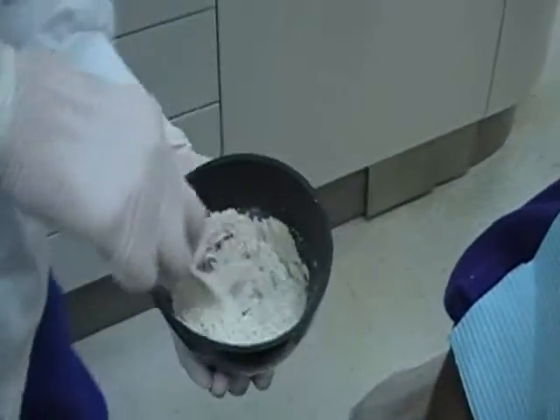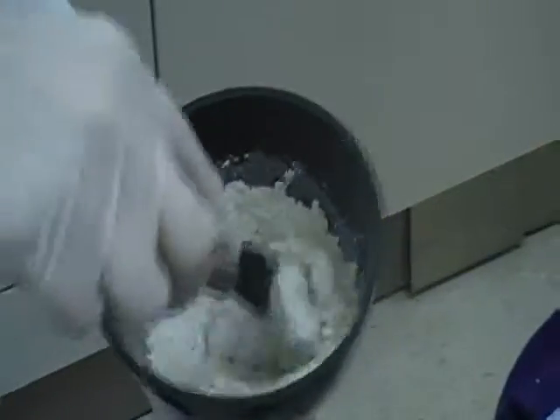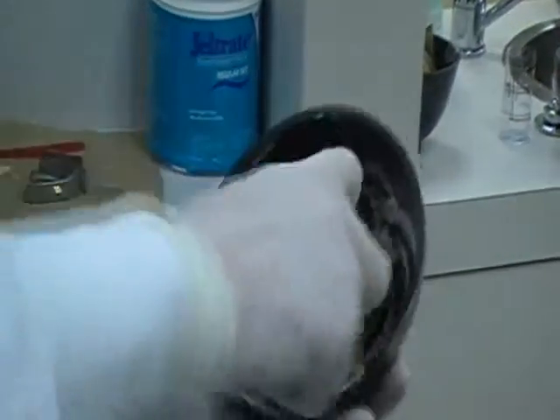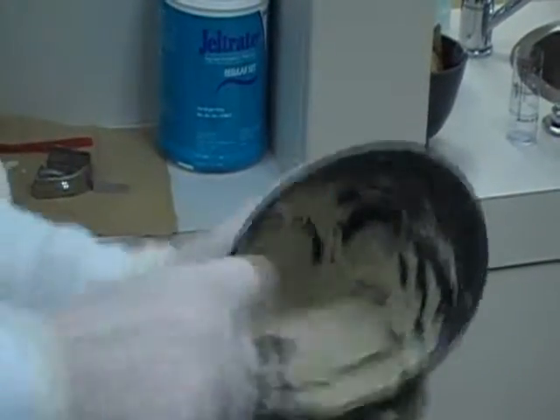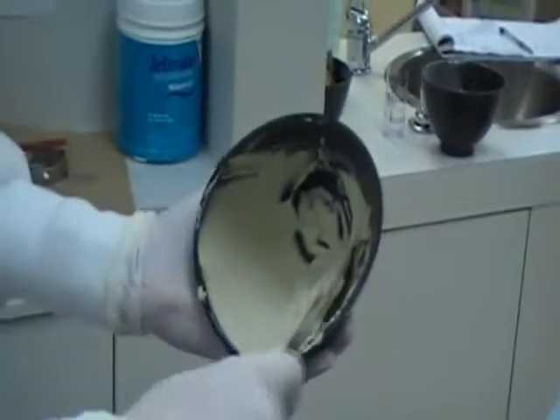Again, wet the powder particles. Remember, the warmer the water is, the more quickly the alginate will set up. Once we have the particles wetted, we turn the bowl on its side and use a back and forth stropping motion. We want a very smooth, creamy mix. Gather it up. By working it like that, you're eliminating a lot of air bubbles.